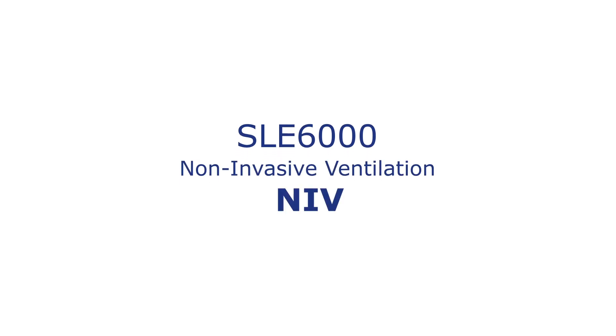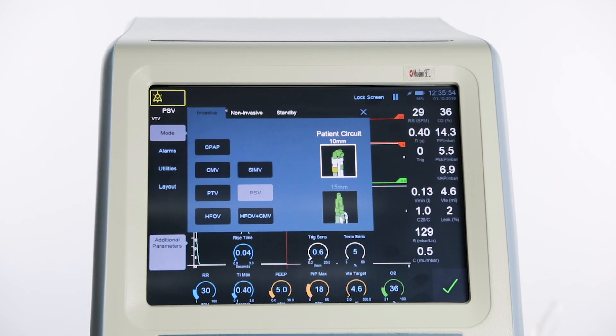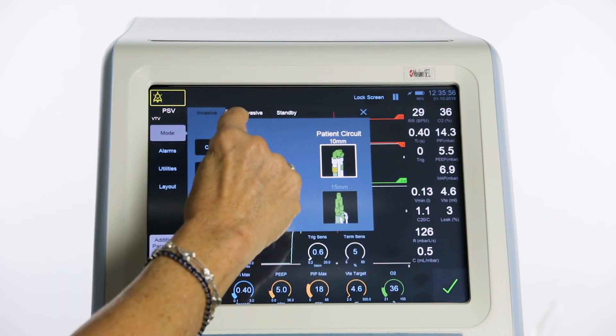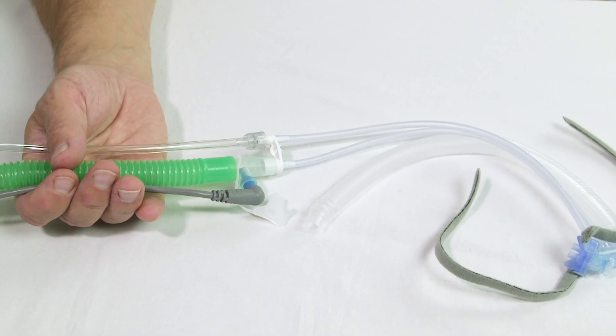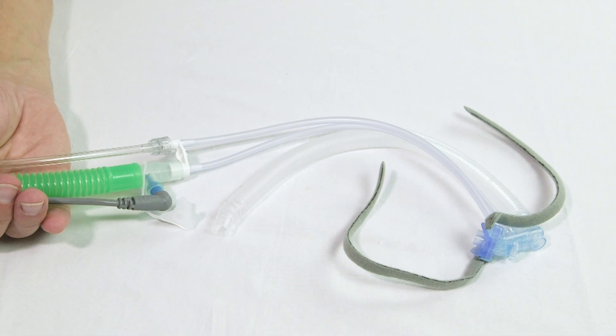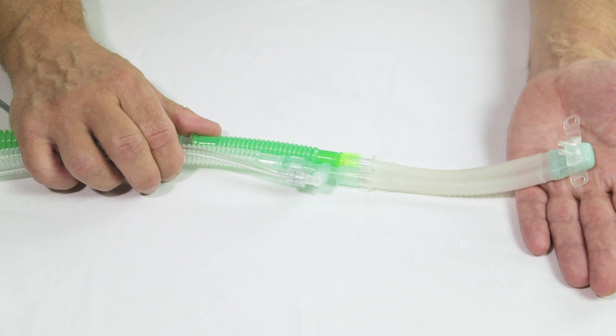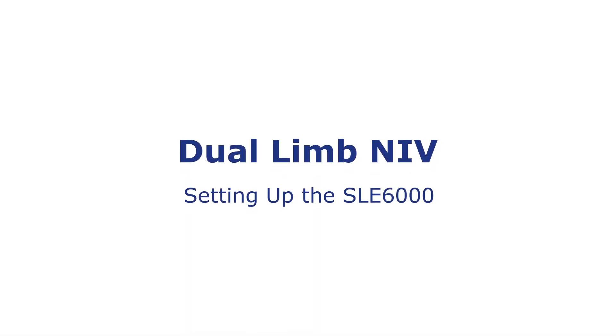Dual limb non-invasive ventilation on the SLE6000. The SLE6000 can be used for both invasive and non-invasive ventilation. In non-invasive modes it may be used with either a single limb circuit or a dual limb circuit, depending upon the clinician's diagnosis and choice of patient interface. Setting up the SLE6000 for dual limb non-invasive ventilation.